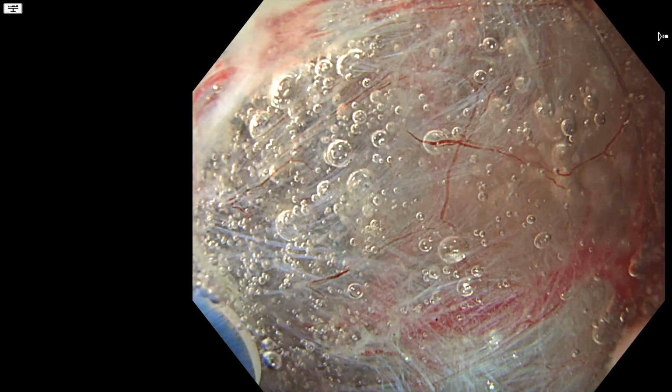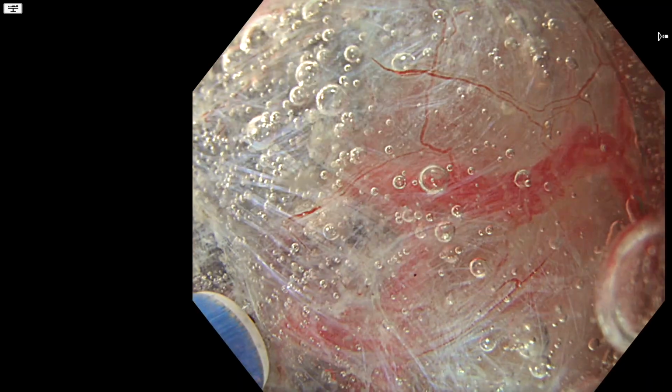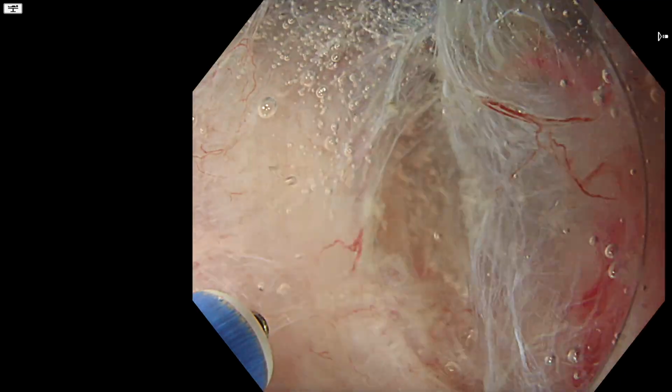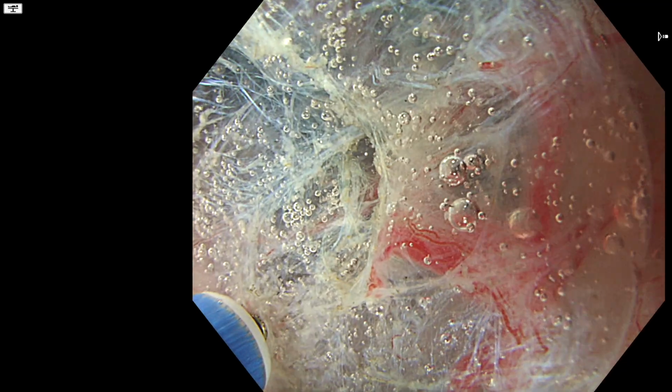So we're just trying to widen the pocket here by opening up the sides a little bit. This is done mainly to ensure that we have sufficient maneuverability once we're inside the intermuscular plane.